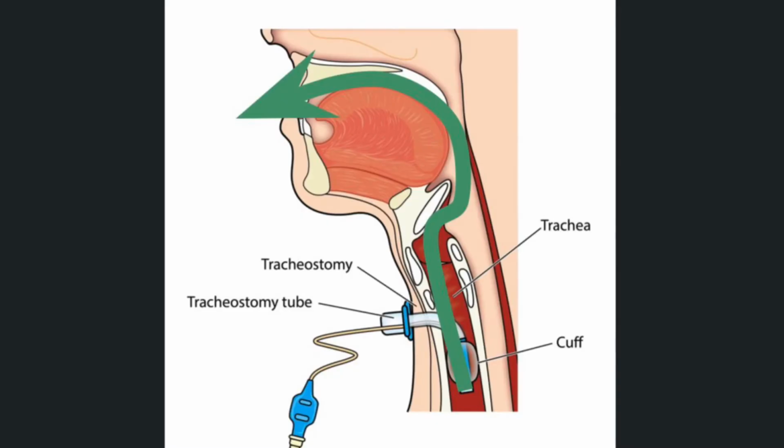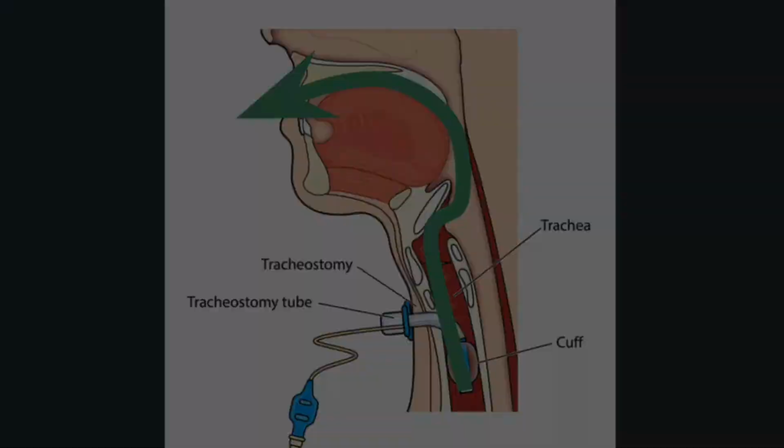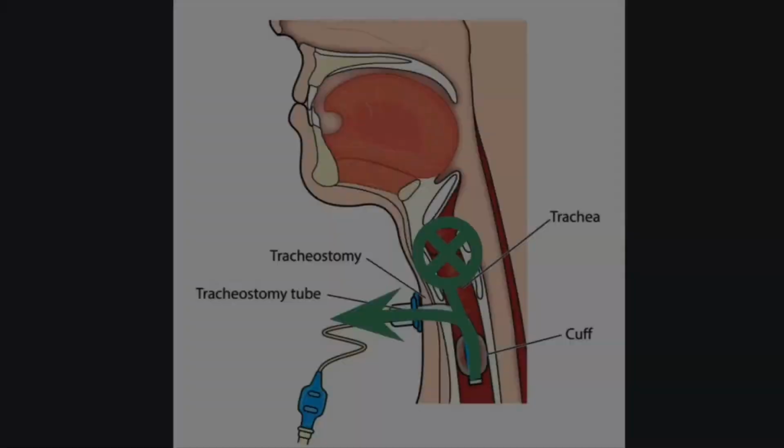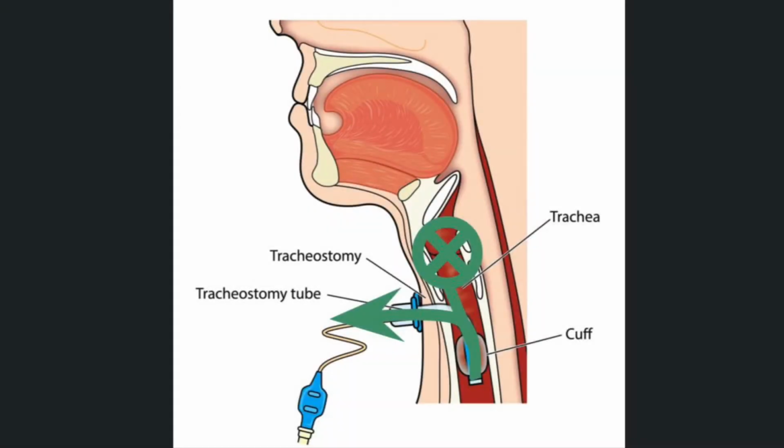After a tracheostomy is performed, the air that normally flows through the voice box and out through the mouth instead flows out through the tracheostomy tube. Because of this, patients temporarily will have no audible voice, as the air does not vibrate the voice box since it's escaping through the neck. Similarly, patients cough through their tracheostomy tube instead of through the mouth.